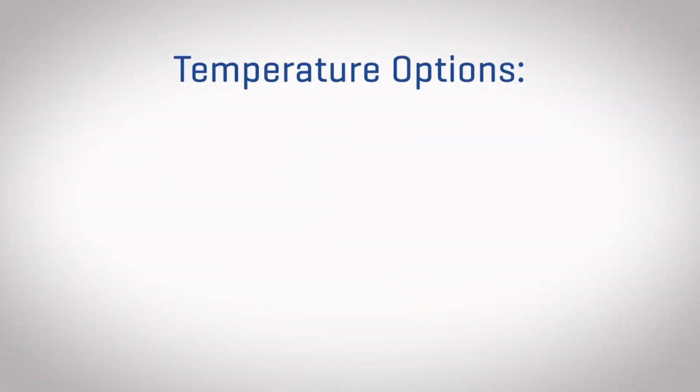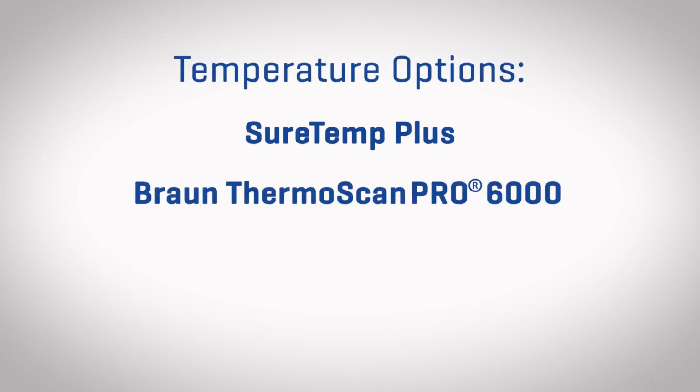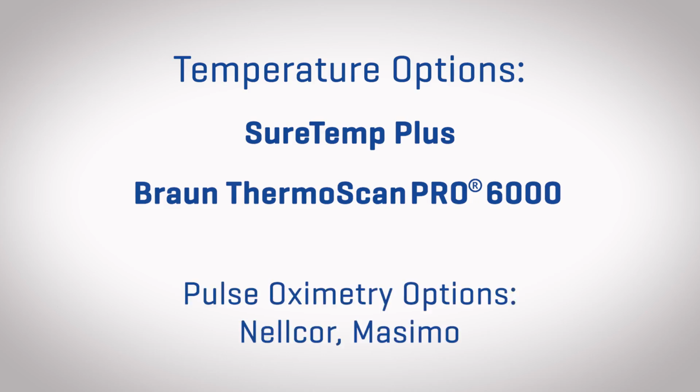Temperature options include oral, axillary, and rectal, with the Welch Allyn Sure Temp Plus, or tympanic with the Braun Pro 6000. Pulse oximetry can be configured to accept sensors from either Nellcor or Masimo.